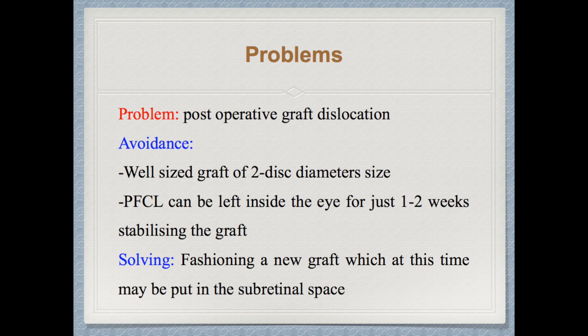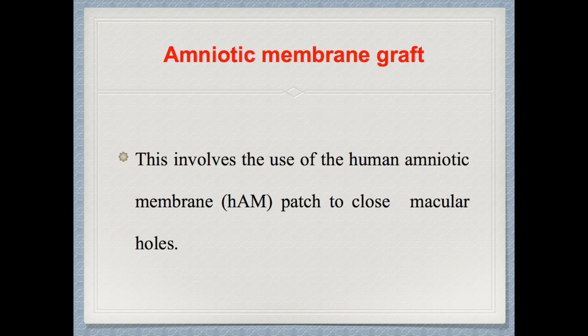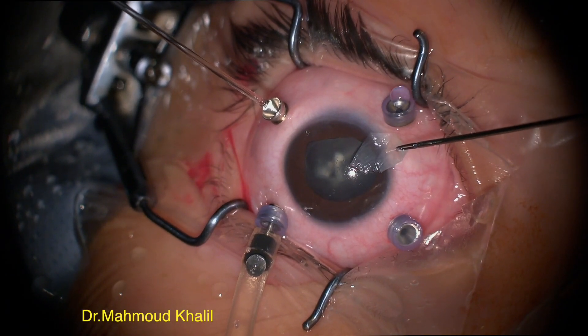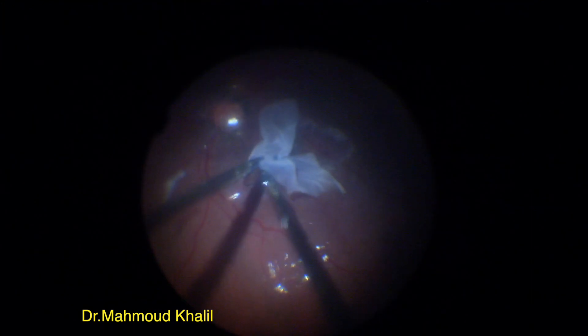The fifth technique is amniotic membrane graft, which involves the use of human amniotic membrane to close the macular hole. As seen in the video, the amniotic membrane is prepared outside the eye, then placed on the surface of the macular hole, followed by injection of peripheral PFCL with the other hand, and then unfolding the amniotic membrane with two forceps, waiting until it is completely unfolded on the surface of the macula.